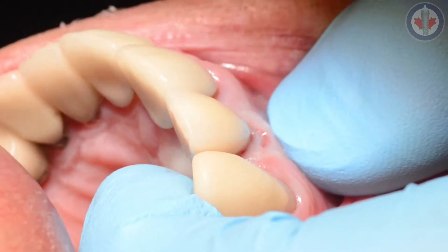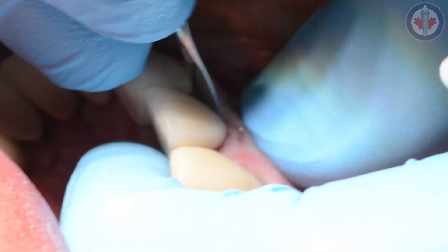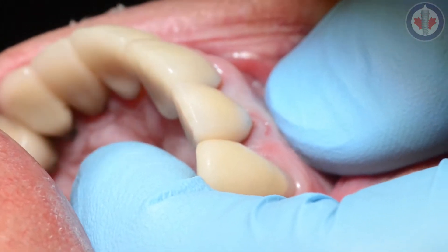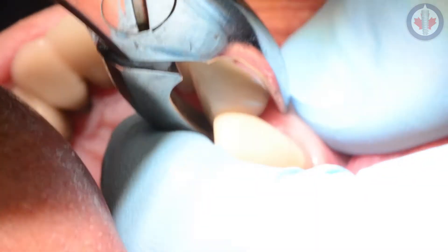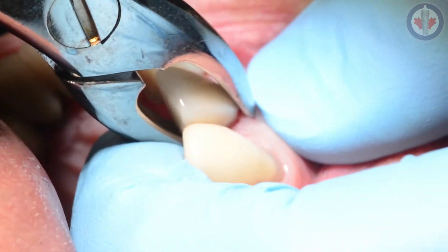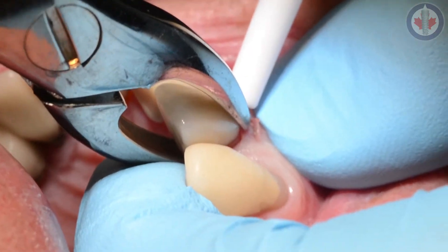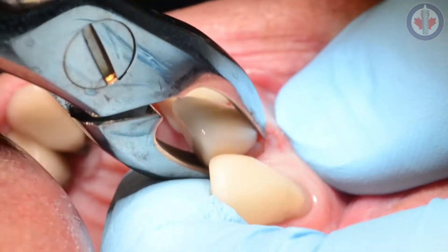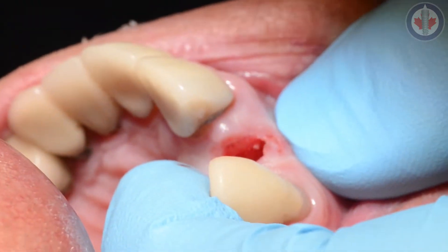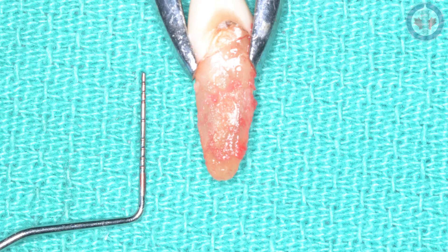Continuing along — adequate soft tissue coverage. In this case, we're going to try to use PRF (platelet-rich fibrin), but we were unable to get blood from this patient, so we'll be using a collar plug along with some bone graft. Ensuring that you have an intact buccal plate is also important for immediate implants. Using the 76S forcep to remove this tooth, it comes out in one nice piece. You can see in this photograph how that 76S forcep holds the tooth really nicely.